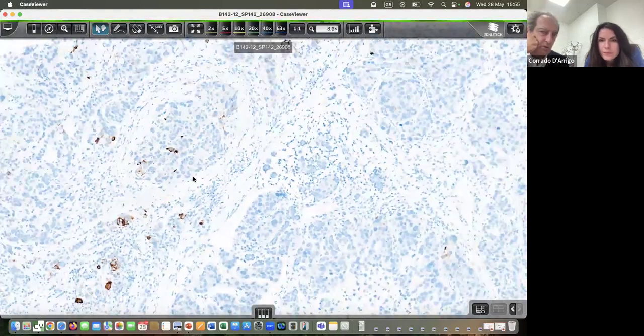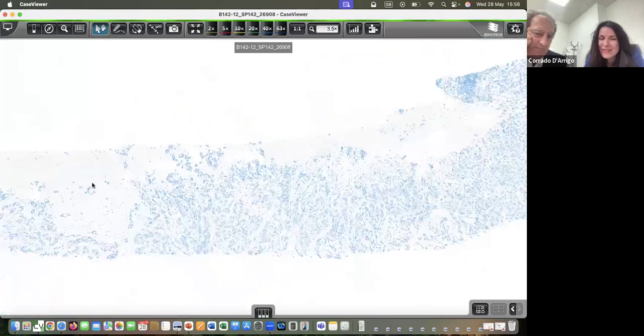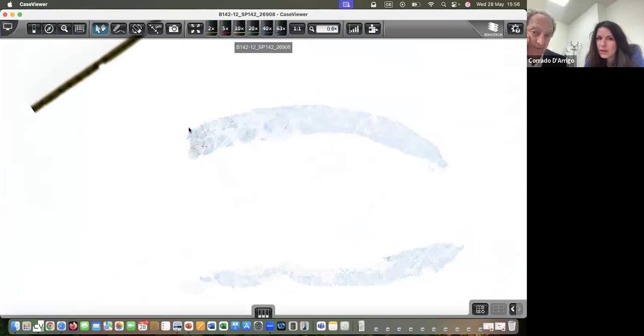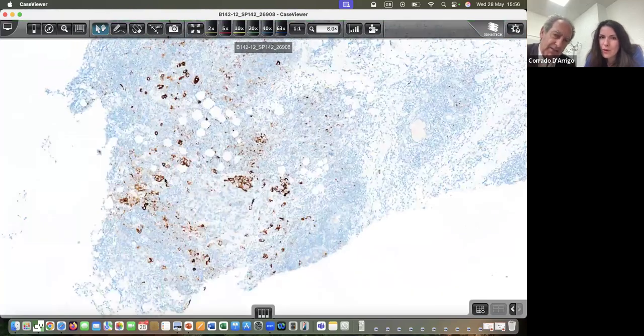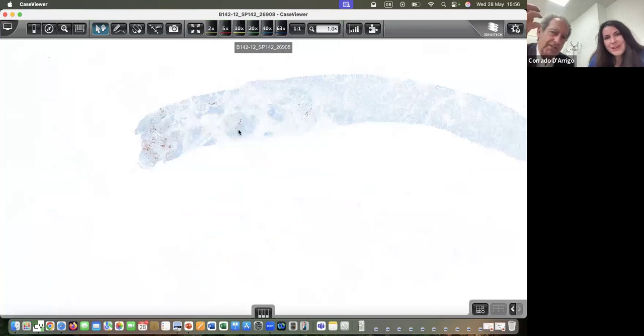I feel less confident to call this positive because of the visual impact of the tumor cell staining. I think this predominates really. So would you call this negative? At the same time, you have a lot of immune cell staining here. So what is the answer? I don't know. Part of the tumor is really expressing, there is a crosstalk between the immune cells and the tumor here.